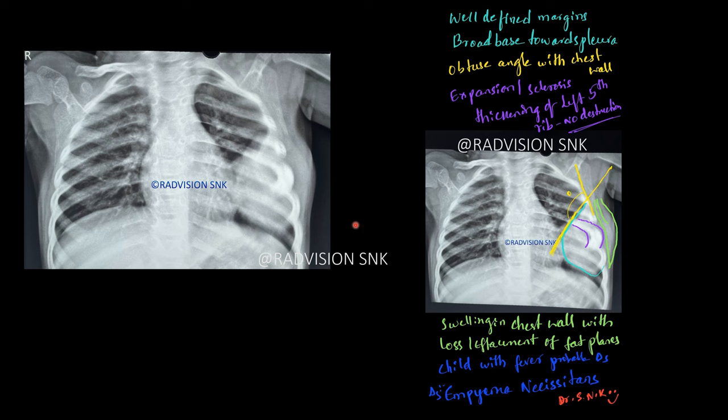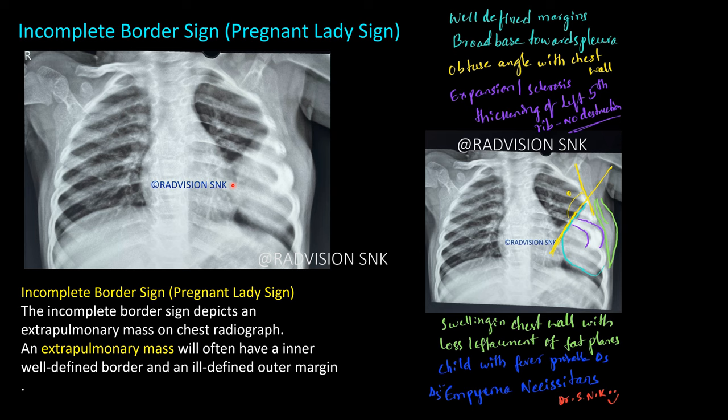This was a case of empyema necessitans. The sign to remember is the incomplete border sign or pregnant lady sign: the medial borders are very clearly and sharply demarcated compared to the lateral borders, because the X-ray rays are tangential to the medial border. The lateral borders are seen merging with the chest wall. The obtuse angle between the mass and the chest wall differentiates extra-pulmonary masses from pulmonary masses.